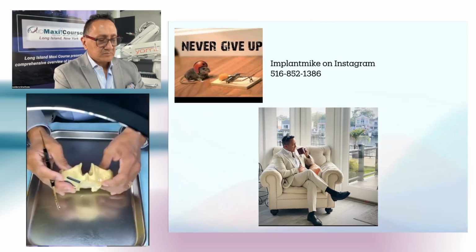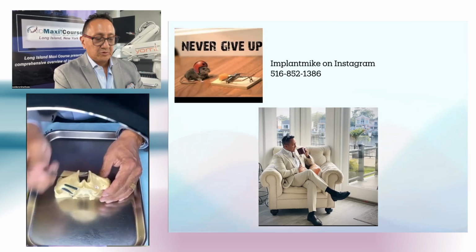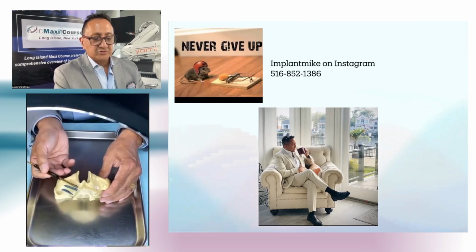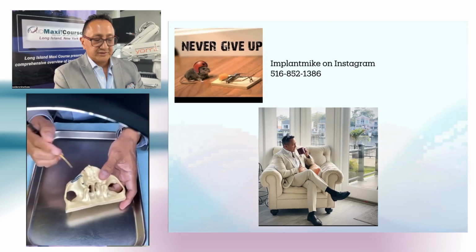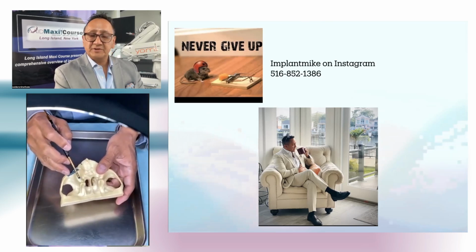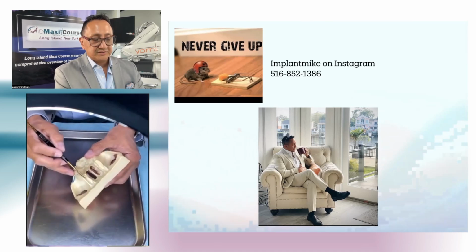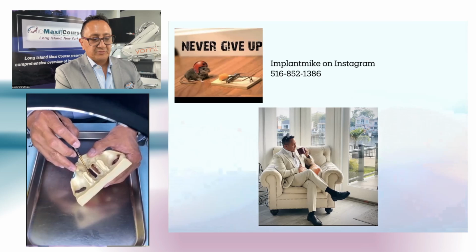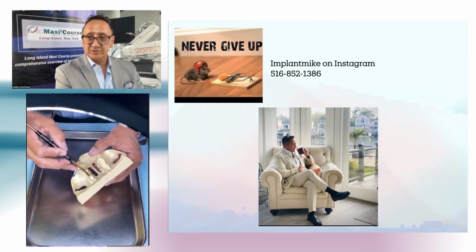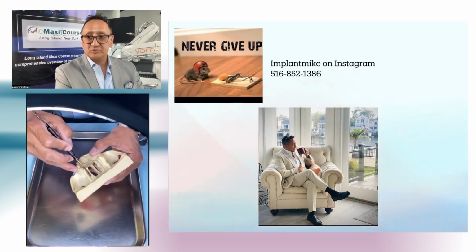All right. So I wanted you to see this, appreciate it, because you can do a lateral wall sinus lift, or you can do zygomas. And along with zygomas, you have to add something called a pterygoid. Now, if you see this pterygoid implant being placed here in this model, this is how I learned. And it's coming through. These are the lateral pterygoid and medial pterygoid plates. It came through the medial pterygoid plate. You don't want that. You want to aim for the middle here, in between the plates, right? I mean, this is acceptable, but in between these two plates is what's best.